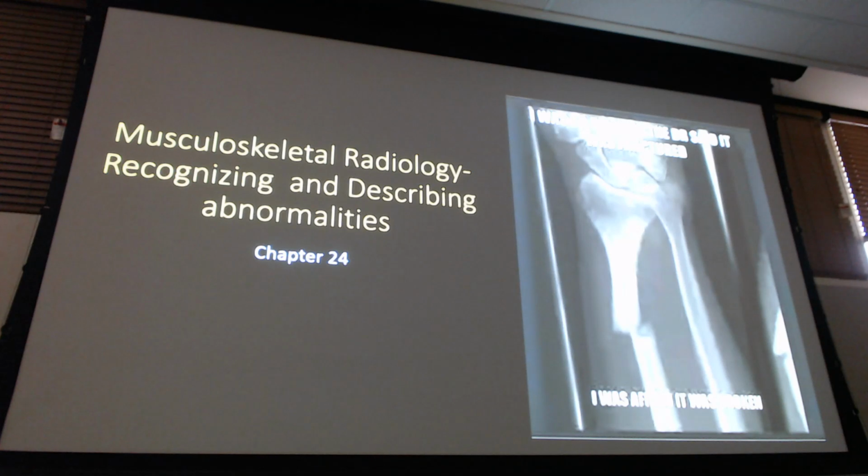Does that track? I'm showing you the advanced x-ray, so if you see an avascular necrosis, you know what it looks like. The goal is that you can pull out the scaphoid fractures via the repeat x-ray or the MRI as the study of choice to get a hold of that patient before the scaphoid starts to necrose and you have the avascular necrosis.